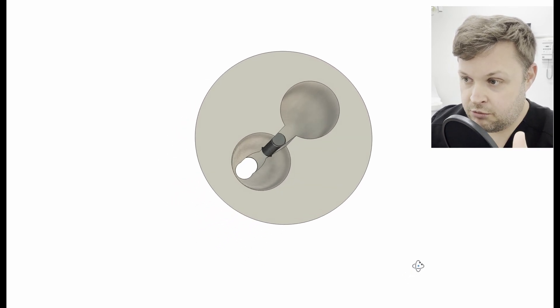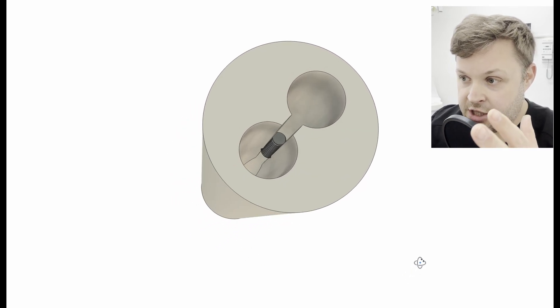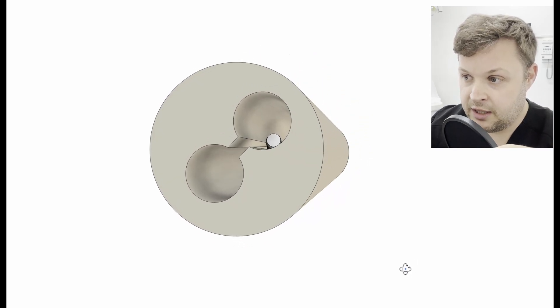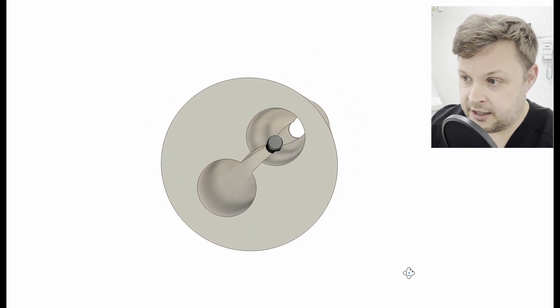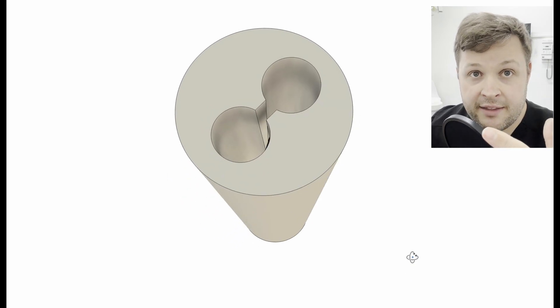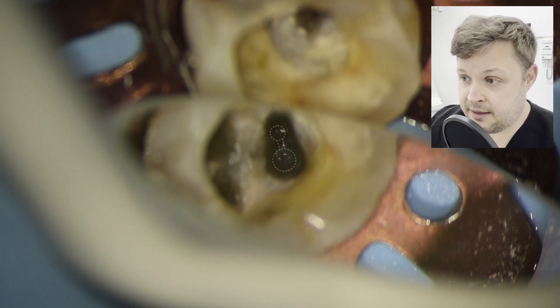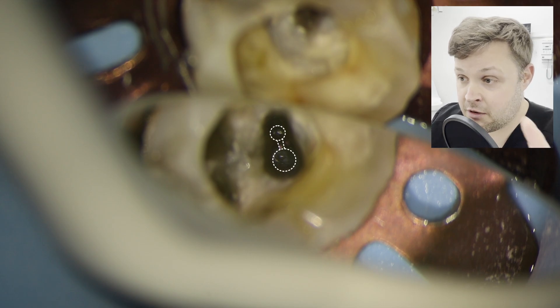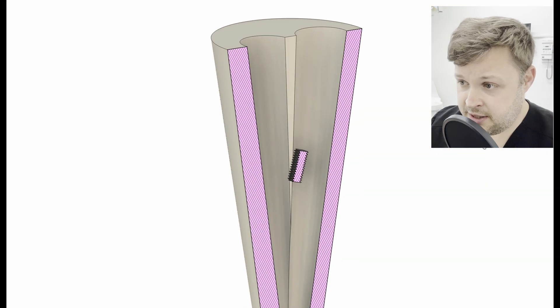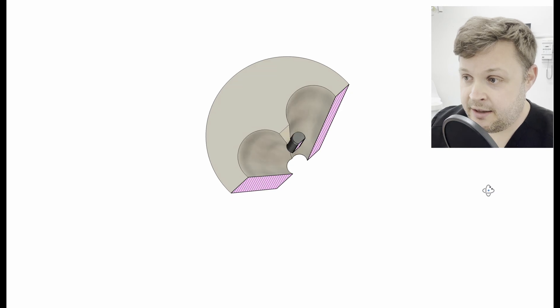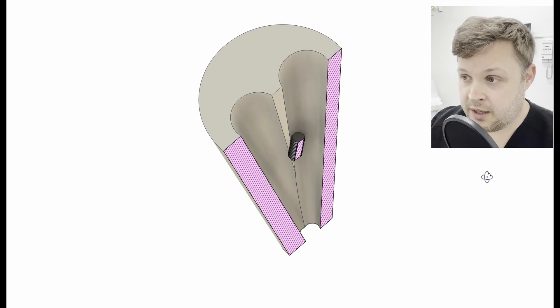I want to use a 3D render here to show you exactly where this file is. It's a distal root with two canals, and the two canals have quite a long fissure down the middle where they are closely associated — it's kind of a figure-of-eight configuration. Using another 3D render, you can see this is where the file is stuck: it's stuck between the two canals.